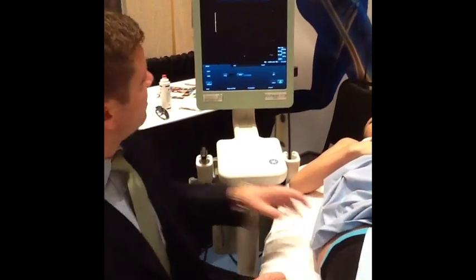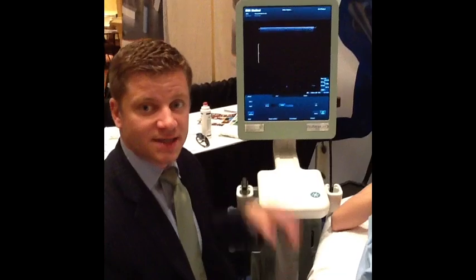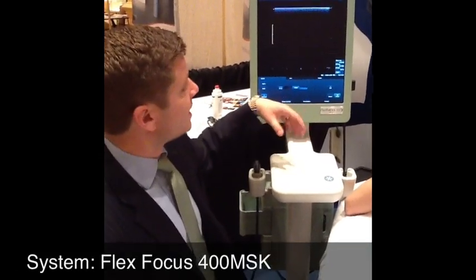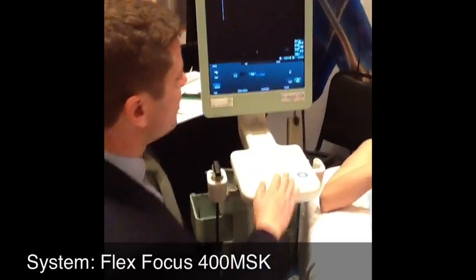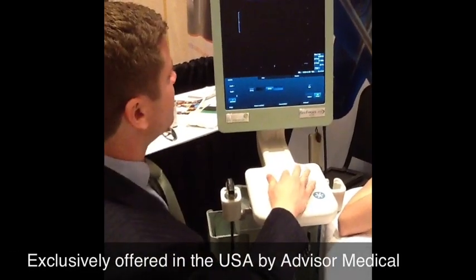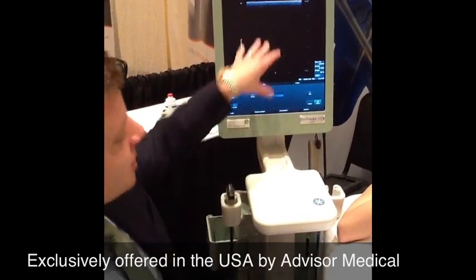This is the intra-articular hip and a couple things before I even get to the technique and how it's done — we want to set up our ultrasound system. We can do the easy route and just go to a preset but I'm going to do this manually just so you can see it. I want my depth to be around 5 cm, 12 MHz, and then my focal zone I want to bring down to about three-quarters of the way down the screen.